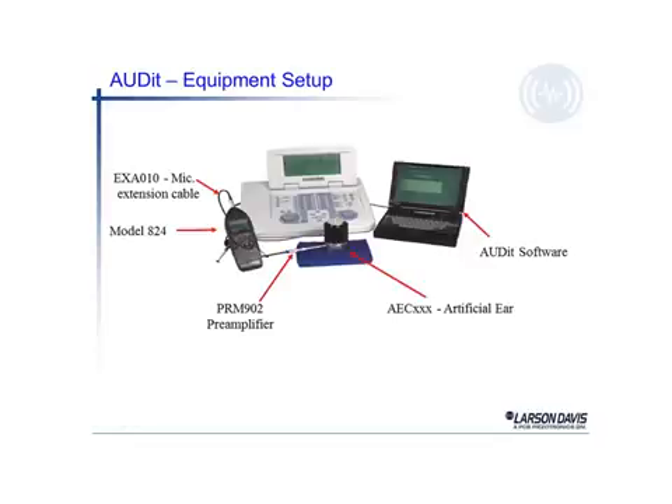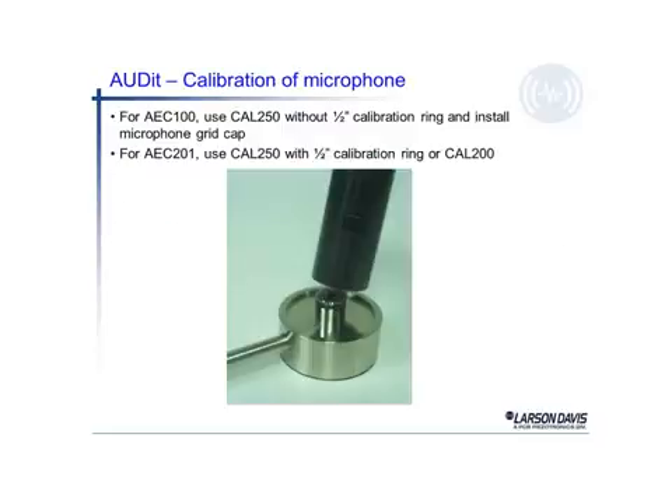There's also a little weight on top of the earphone, which keeps the earphone in place over the artificial ear. The software is run on a PC, which is connected to the 824 sound level meter and does the data gathering for us as we go through the audit software test.